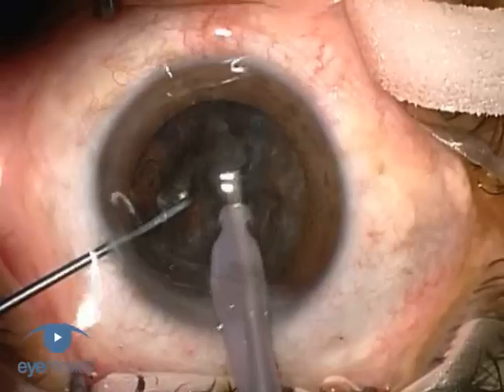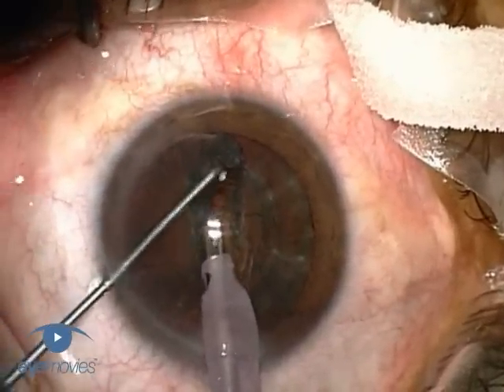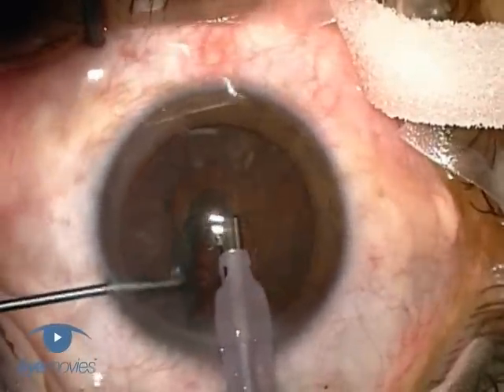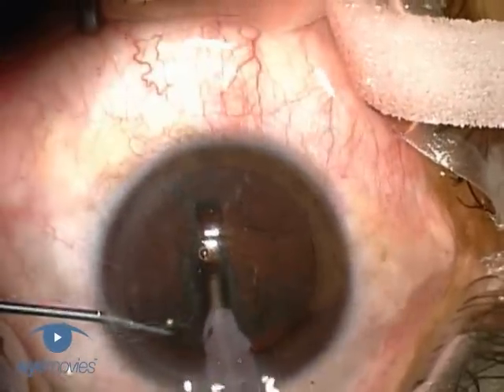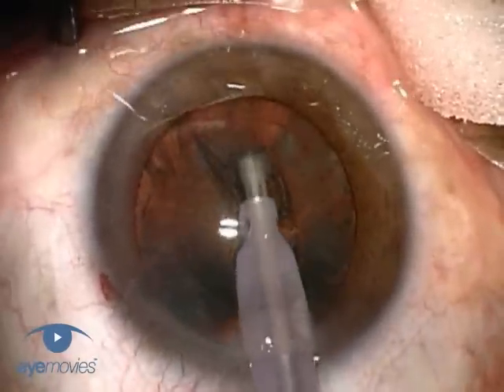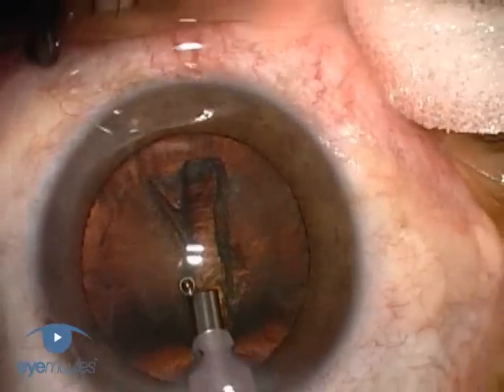The stop and chop technique is a useful one to use as an introduction to nuclear chopping, because it combines the familiar sculpting introduction of a phaco procedure with nuclear chopping in a safe environment, and it can be converted to a divide and conquer technique at almost any stage. The initial stages of stop and chop involve making a deep central groove roughly the diameter of the lens, which creates space into which fragments can be chopped.